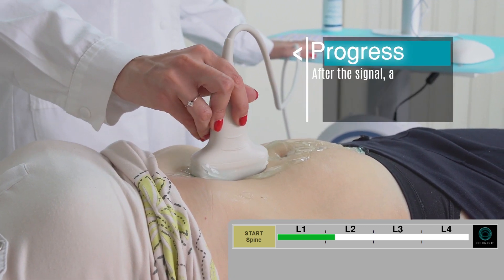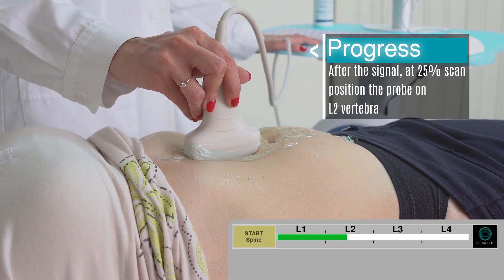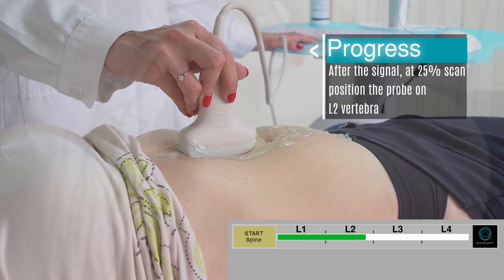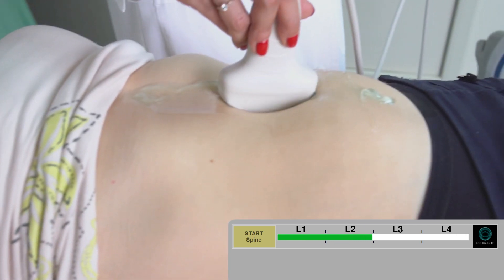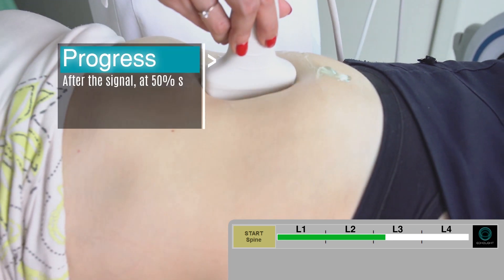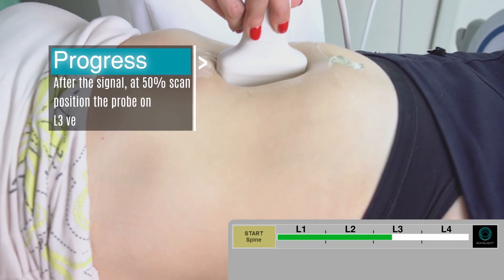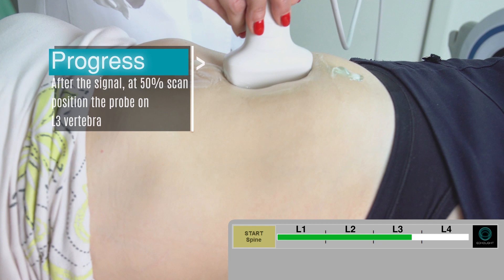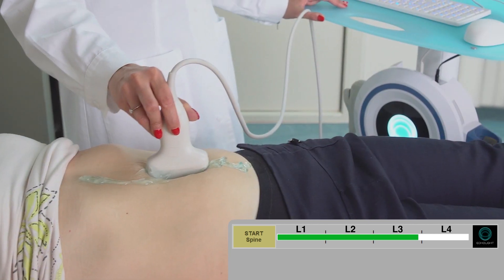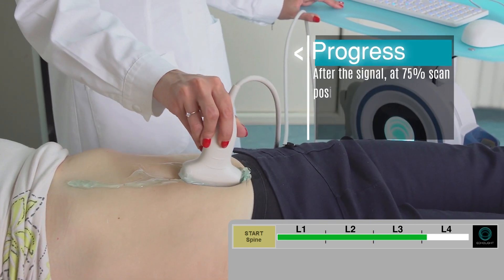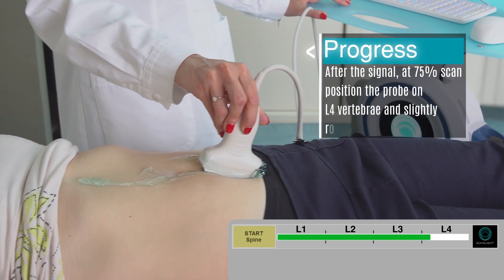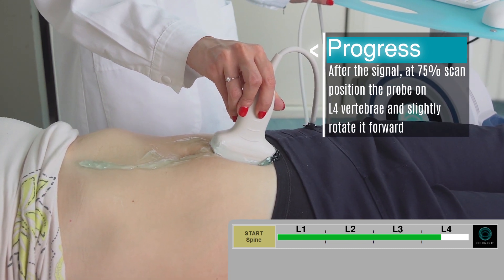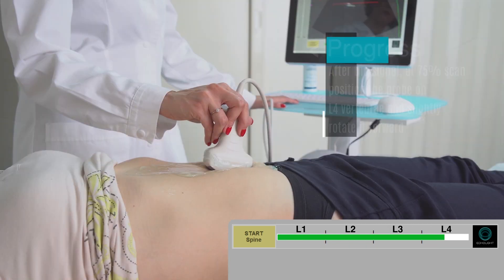After the signal at 25% progression, position the probe on L2 vertebra. After the signal at 50% progression, position the probe on L3 vertebra. Lastly, at 75% progression, position the probe on L4 vertebra and slightly rotate it forward.